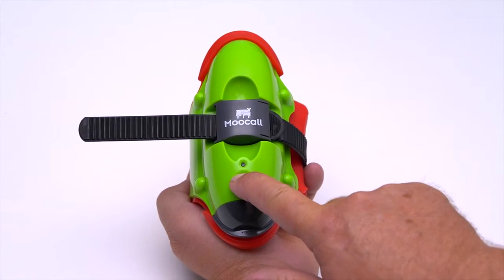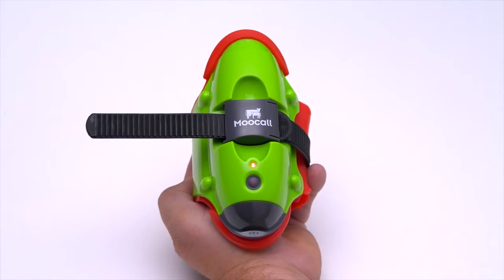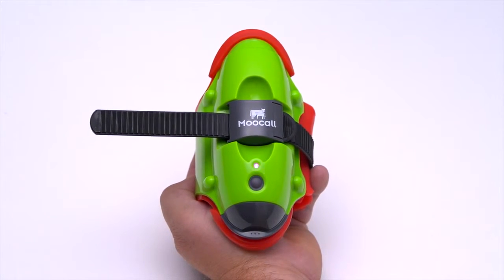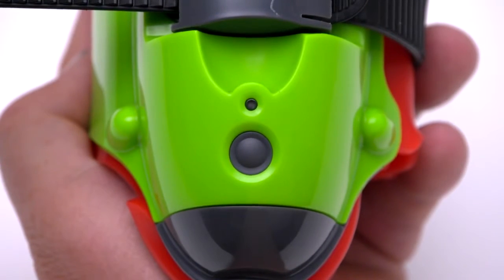Turn on the sensor by pressing the power button. The LED light will flash red, green and blue for one minute, and then the blinking blue light will indicate that the sensor is ready for use.